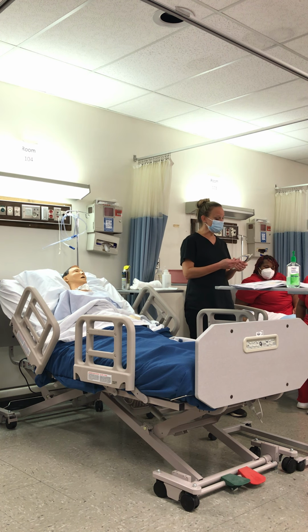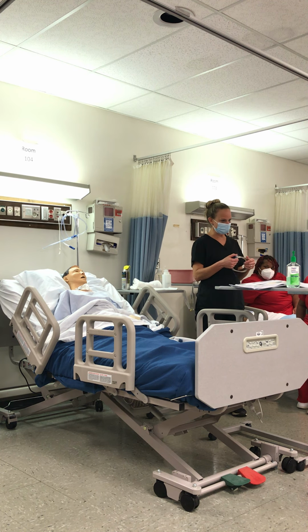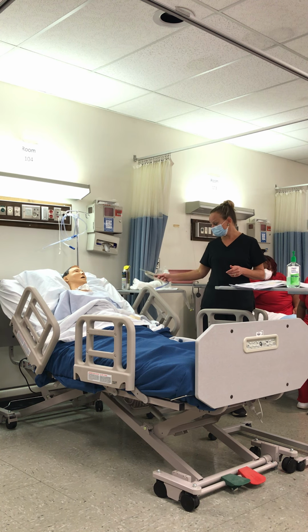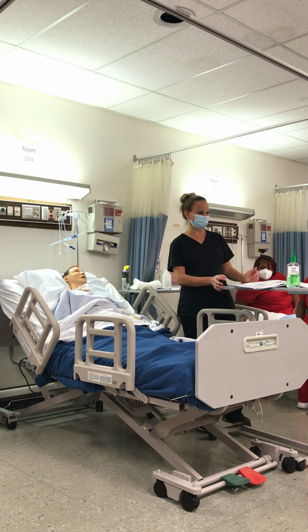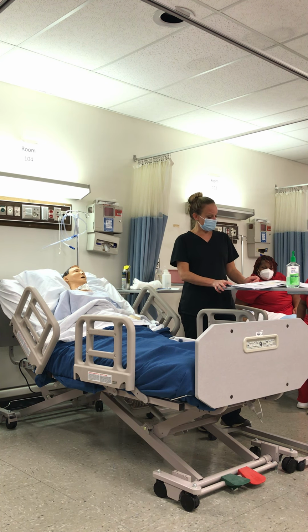So the thing is, we've got to think about, is this going into the belly? Is the belly clean? No. It's not really considered clean, okay? So if I had a choice, or if I was doing this to an actual patient, yes, I'd probably already put my gloves on after I wash my hands, but I didn't do that. I'm following this crazy list.